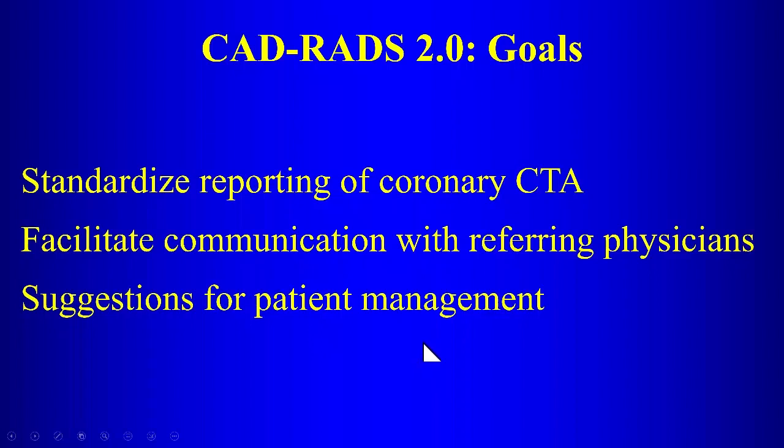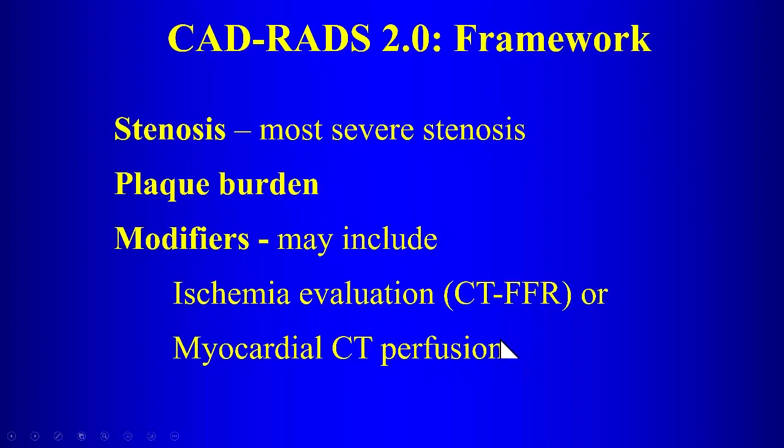That's true in all of these scoring systems that we use, whether it's Lung-RADS or liver, or thyroid, whatever, that there are suggestions for patient management there. Now there are downsides of imposing these scoring systems also because it gives everybody tunnel vision, right? And then it forces this paradigm on you in terms of how you are supposed to look at these studies, okay? But this is the standardization that everybody seems to want to do, right?